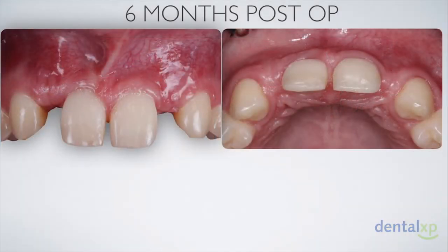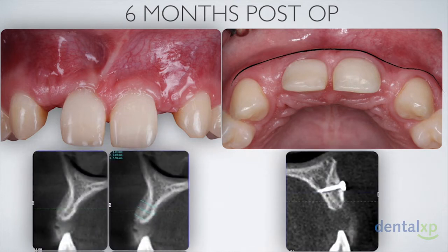So when the patient returned for the 6 months follow-up, the clinical contours of the sponge site seemed to have responded better than the block graft area. However, when the CT scan was taken, you could clearly see that the bone volume achieved by the block graft is significantly greater than the sponge. Having said that, this is a demineralized sponge and requires usually about 7 to 8 months to start showing evidence of adequate radiopacity, so this is something we have to bear in mind.